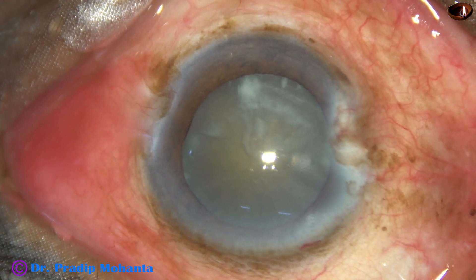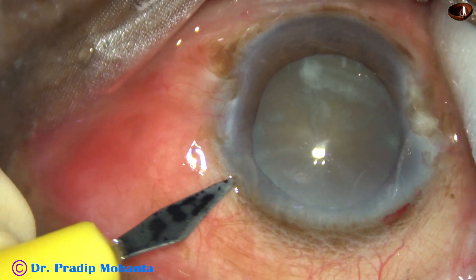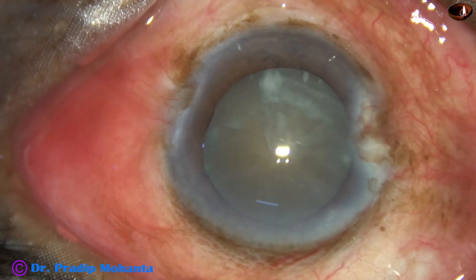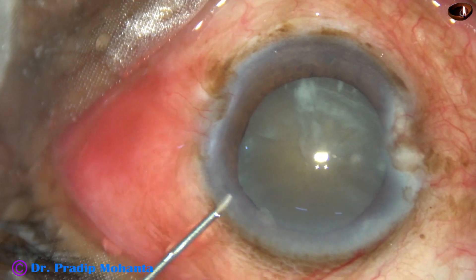We can see that the cataract is not very hard. If we consider the age of the patient — 104 years old — this cataract nucleus sclerosis is about grade 3 plus or grade 4.